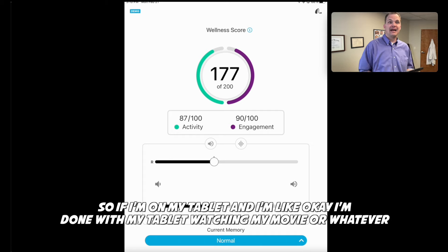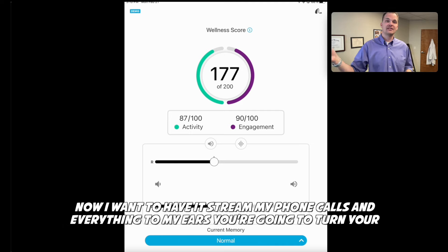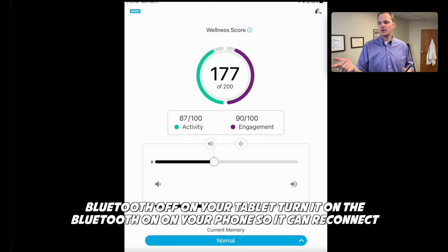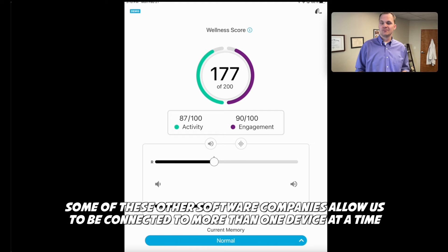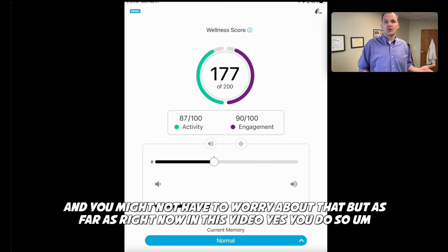So if I'm on my tablet watching a movie and now I want to stream phone calls to my ears, I'm going to turn Bluetooth off on my tablet and turn Bluetooth on on my phone so it can reconnect to that one device. That might change in the future when Apple and other software companies allow connection to more than one device at a time, but right now you do have to switch.